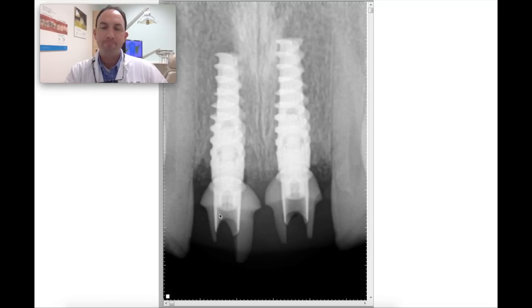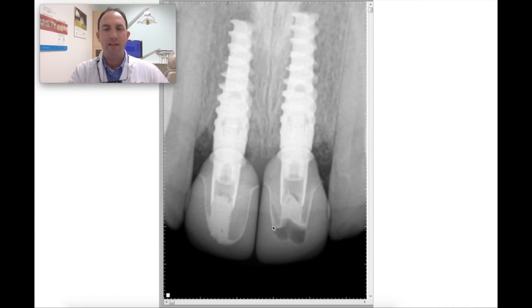So here's the pre-seat crown x-ray before we put the crowns in. I packed some Teflon, Teflon tape, you know, plumber's tape, up into the access holes before cementing the crowns, and I cemented them with Variolink Esthetic. And you'll notice it looks like we got a little bubble here when the assistant filled the crowns. We have a little bubble of air in that crown. So I'm going to monitor that very closely.